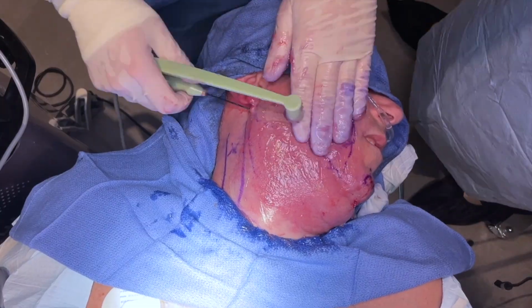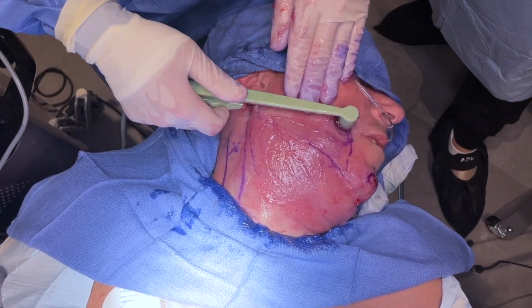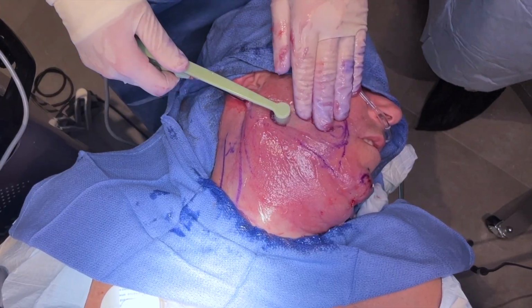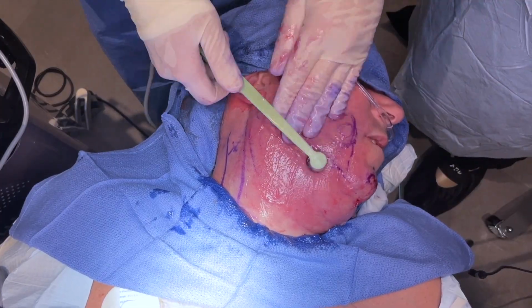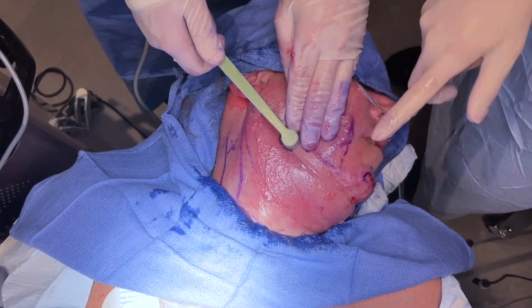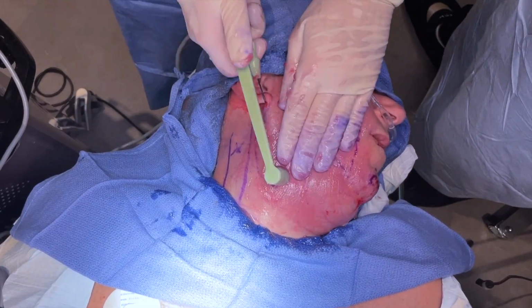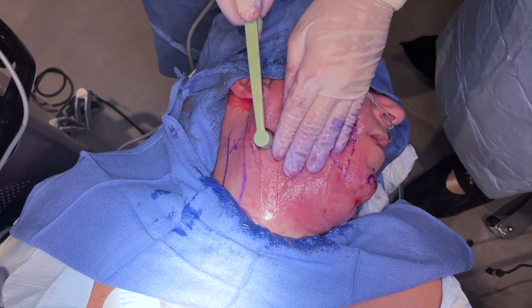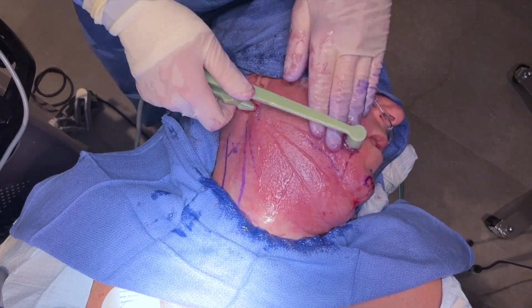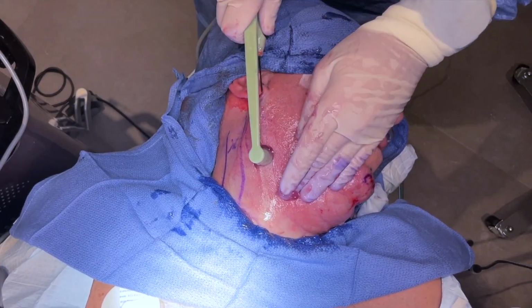And the key here is to apply very consistent passes. They all should be with firm pressure downwards, so the probe is not exiting through the skin and giving you a burn mark. The nice thing about this procedure is that the external temperature is recorded by the electrode. So once the skin gets to a certain temperature, it automatically shuts the radio frequency off. So it's a good safety mechanism to have for the face.